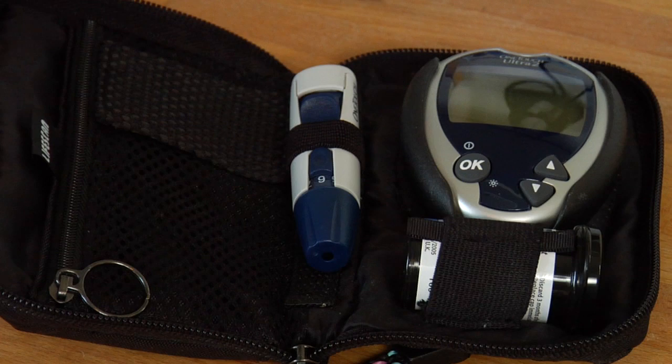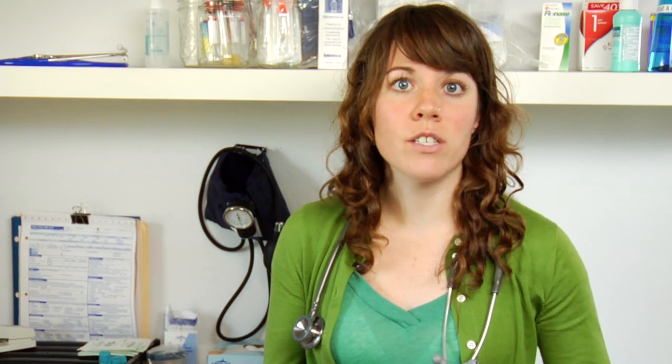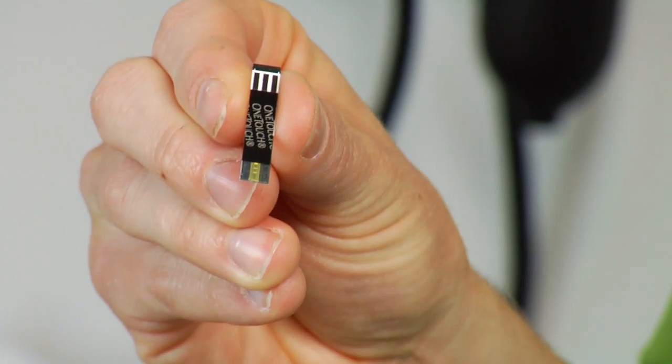We're going to talk about the most commonly used glucometers that are at home. There are a couple of components that they all have, and I'm just going to walk through those. You want to have all of your supplies ready. If you are getting a new bottle of test strips, you want to make sure that your monitor is coded with the code on the test strips. That's important to do when you turn your monitor on.